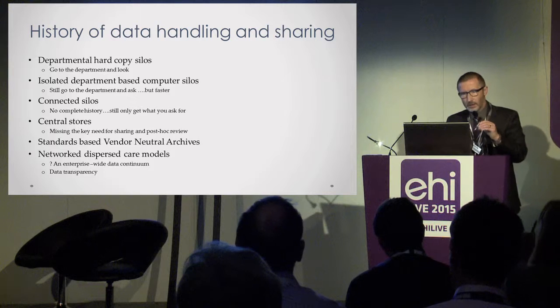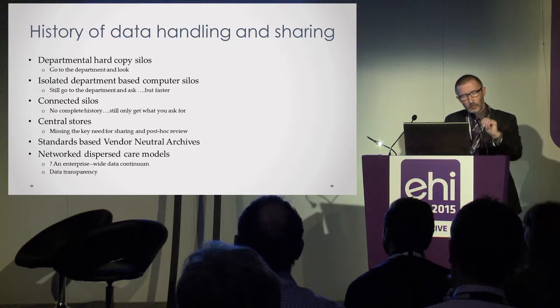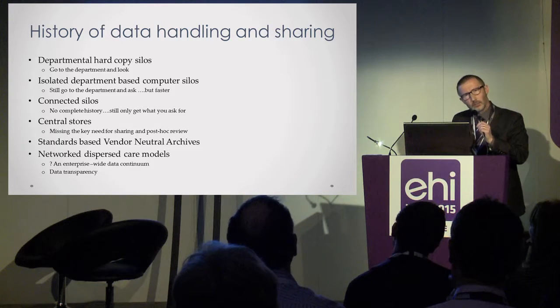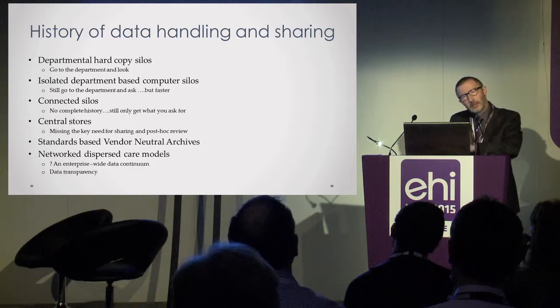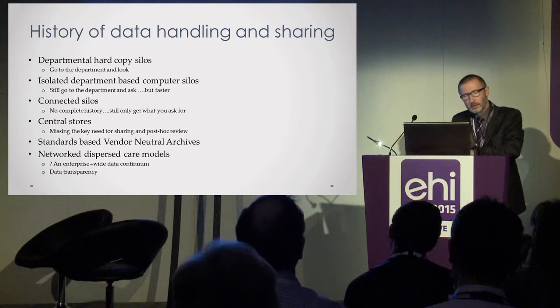Let's look at the history of data handling and sharing that we've gone through. In the old days of cut film, we had the departmental hard copy silos. When I started working as a doctor in the hospital, the radiology pictures, the films, never left the department. Tiny copies were made and given out to the clinicians, but if they wanted to see the x-rays, they had to come and look in the department.